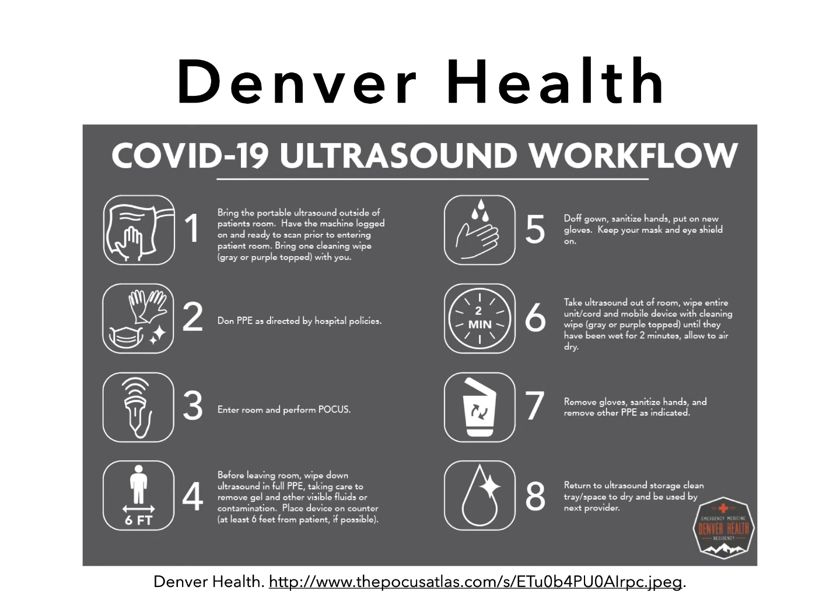The machine should be cleaned both in the patient room immediately after use and outside the room after removing your personal protective equipment.